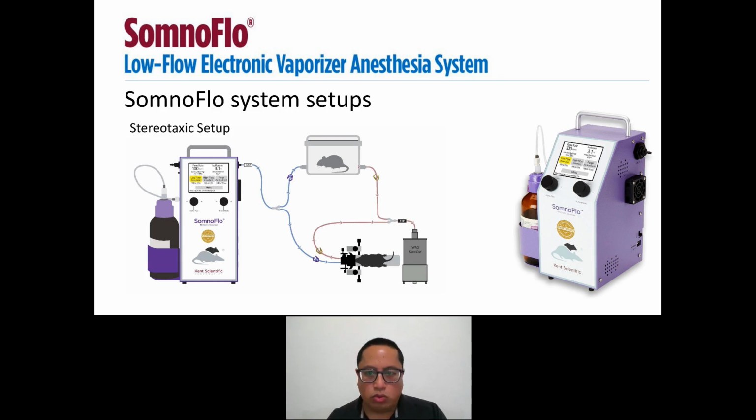With the stereotaxic systems, we actually do not provide any masks for this specific stereotaxic tooth bar face mask. We do provide adapters that will allow you to connect the inspiratory and expiratory lines from the Somno Suite, or from the Somno system, to your inlet ports for your stereotaxic system. So again, we don't provide the masks specifically, but we do provide adapters that will hopefully connect to your stereotaxic setup. And I think it connects with several of the common stereotaxic systems. Correct.